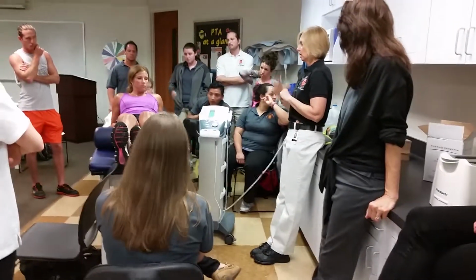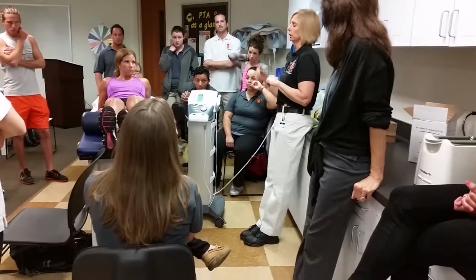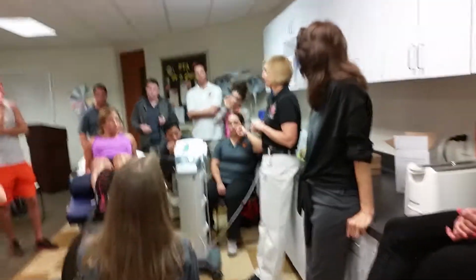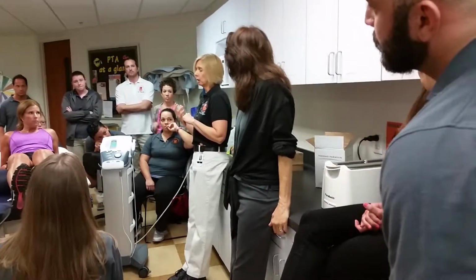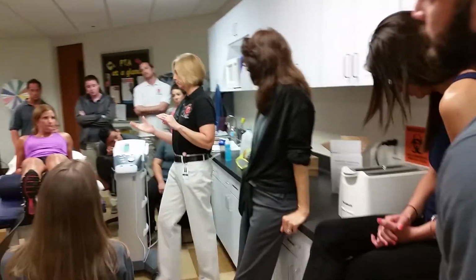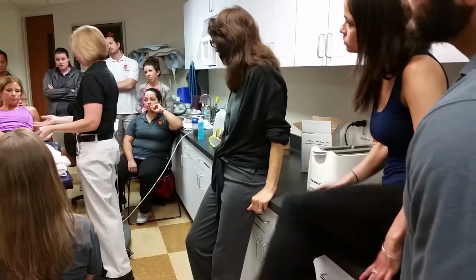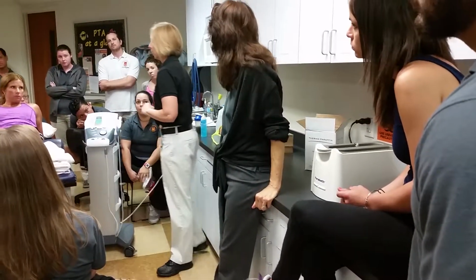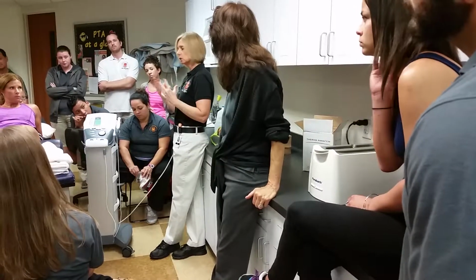Okay. I forgot to ask questions, but basically, do I need to ask her if she's pregnant? I need to ask her, because I'm using a heating element, does she have a blood clot in the area? And I'm looking at her. What happens when someone has a blood clot in their lower extremity? What does it look like?